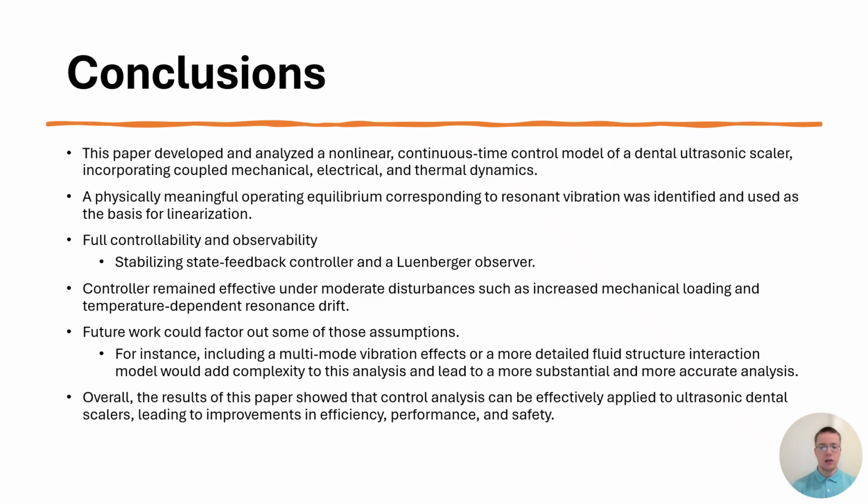Future work could factor out some of those assumptions we made. For instance, you could include multi-mode vibration effects or a more detailed fluid structure interaction that would all add complexity to the analysis and lead to a more substantial and more accurate analysis. Overall, the results of this project showed that the control analysis can be effectively applied to ultrasonic dental scalers, leading to improvements in efficiency, performance, and safety.